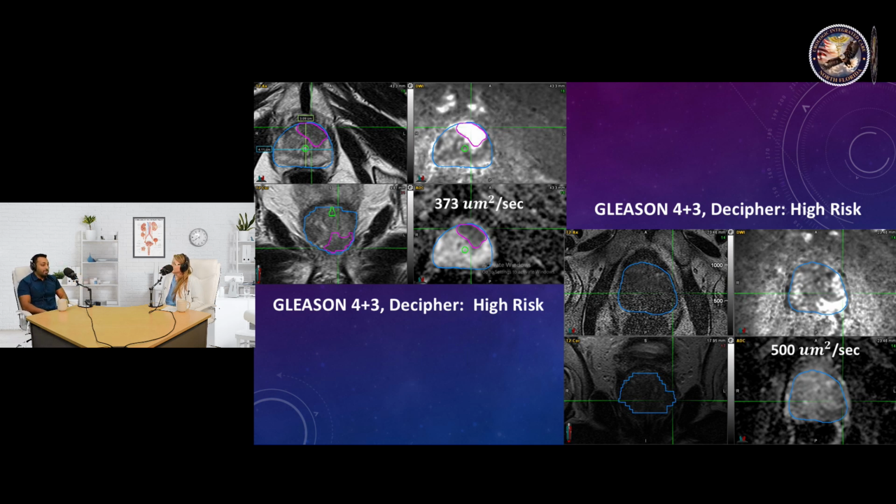I don't know if you've ever brought a phone into an MRI room. Probably shouldn't do that anyway. But if you do, you'll probably immediately lose signal because of that Faraday cage. It's built in a specific way to keep out as much electromagnetic radiation as it can from the outside world, so that the only thing you're measuring from that magnet is the energy created and read by that magnet.